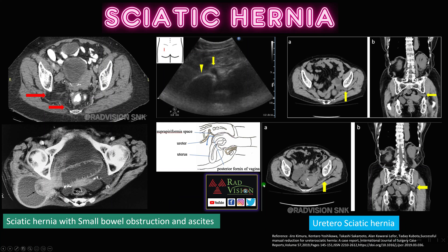Next, sciatic hernia — you can see herniation of fat through the sciatic foramen. Here also you can see sciatic hernia with small bowel obstruction and even ascites. Here there is another case where the ureter and bowel loop are seen in the gluteal region — the ureter is herniating through the sciatic foramen. After transvaginal reduction, the ureter has been completely repositioned. This was a case of uretero-sciatic hernia.